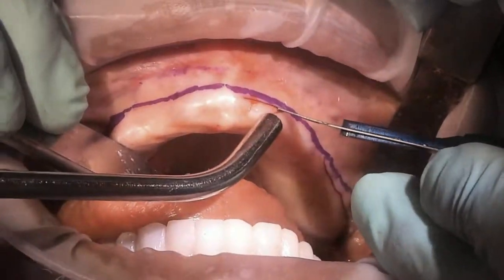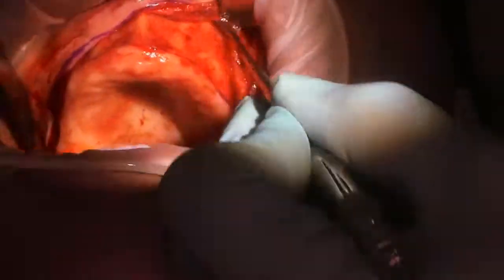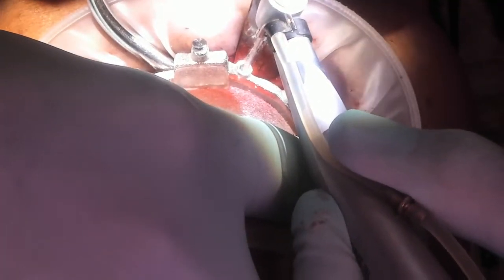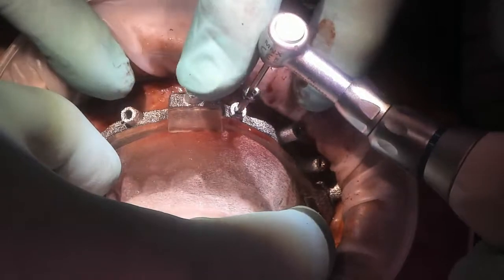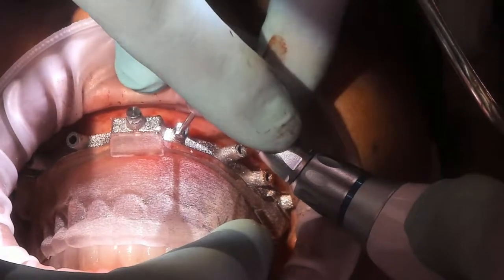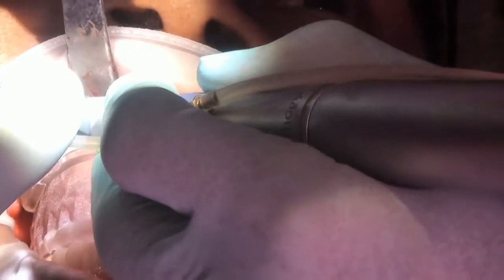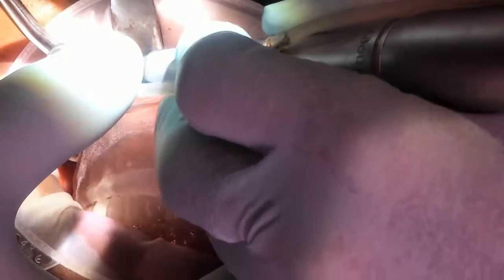A scalpel is used to lay the flap. It's important to note that Dr. Isaac Towell did not drill the labial sites first. This is a technique sometimes chosen in which the flap is created and then the pin guide is inserted and then the sites are drilled. Either option is acceptable. To reiterate, you can either place the pin guides initially and drill all of your sites, or you can lay the flap and allow the pin guide to rest on the tissue on the ridge, the palate, and the maxilla, and then drill the sites after the flap is laid. Either way is acceptable.